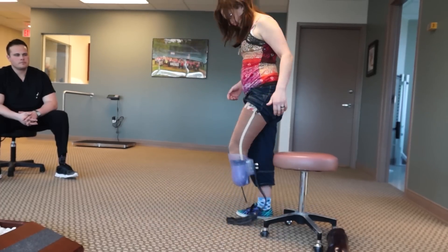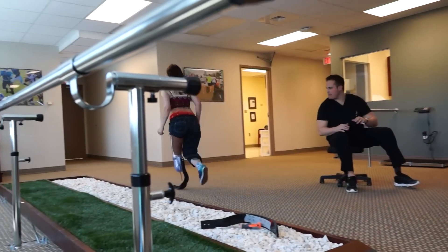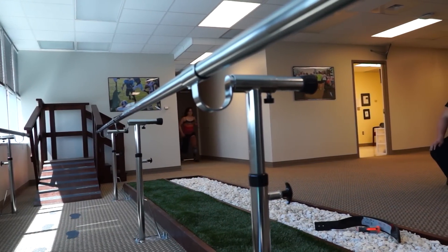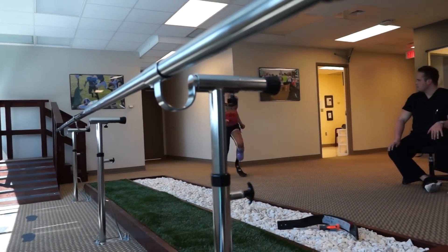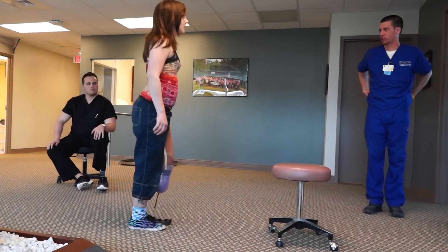The more astute of you will probably notice that this socket looks a little bit too long for me. Running legs are made a little bit taller because they compress down a lot when you run on them. When you walk on them you feel like your legs are uneven, but when you're running it feels like they're the right length.